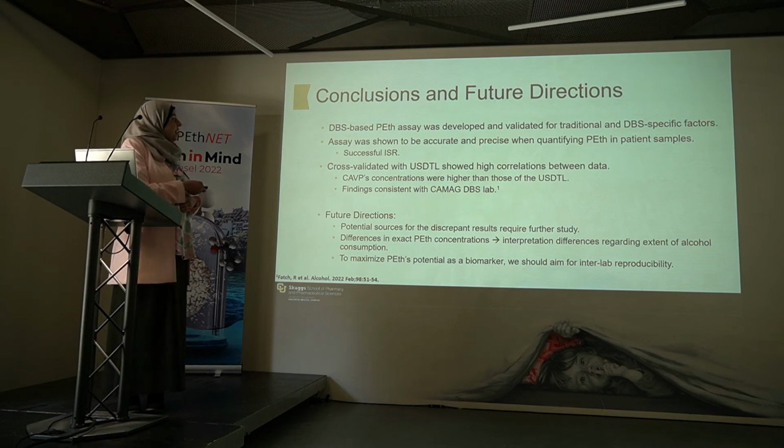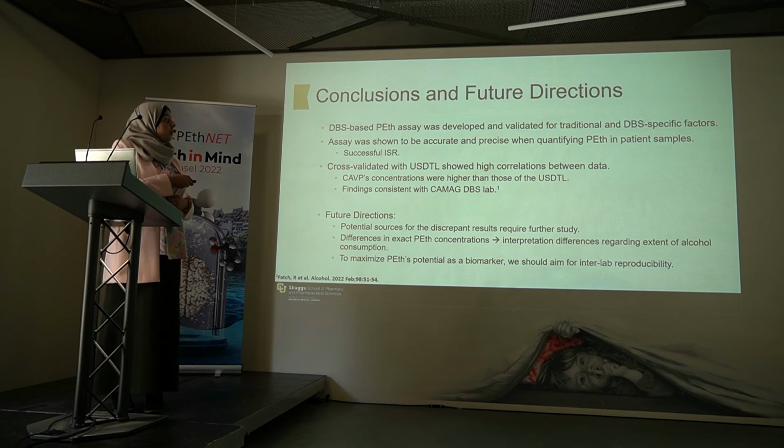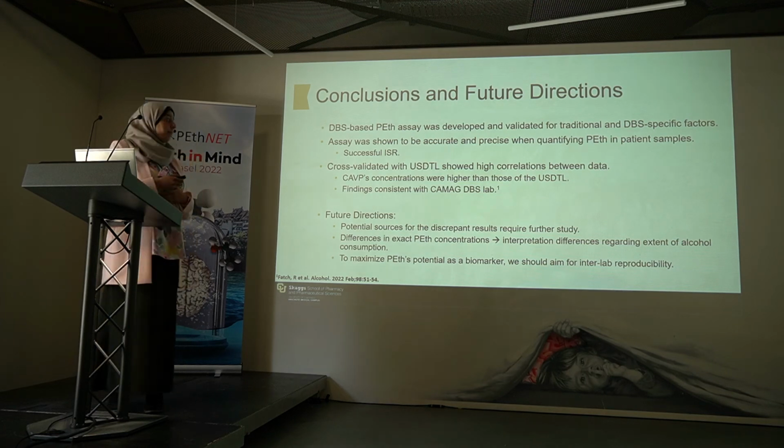And doing the cross-validation with those samples previously quantified by the USDTL, although we were seeing high correlations between our data, our concentrations were higher than those of the USDTL. But these findings are consistent with the CAMAG DBS lab.